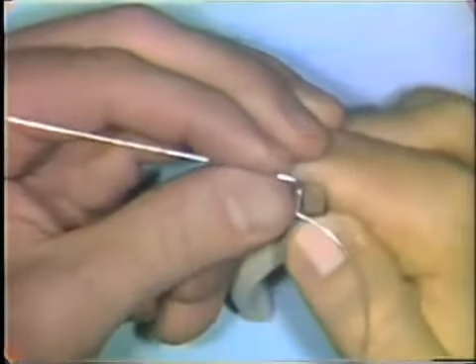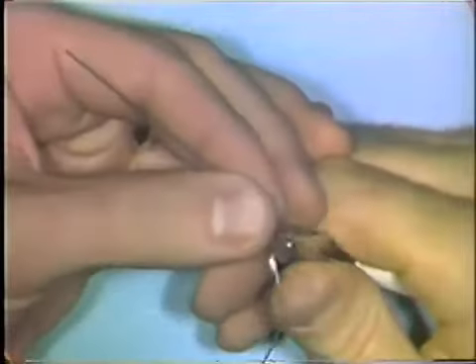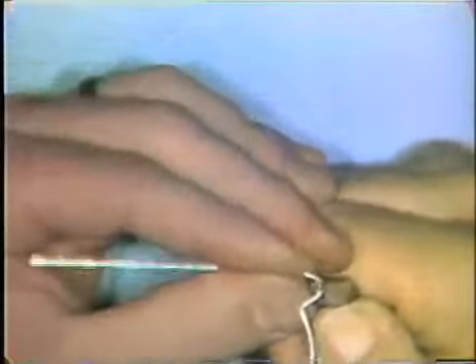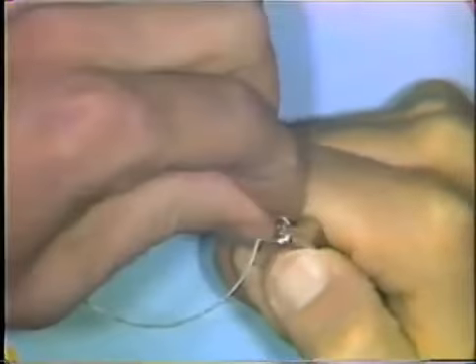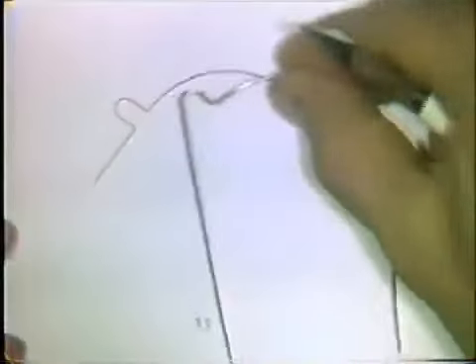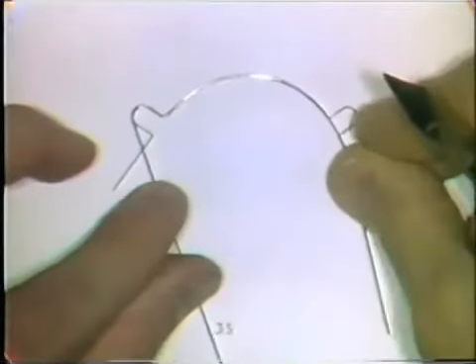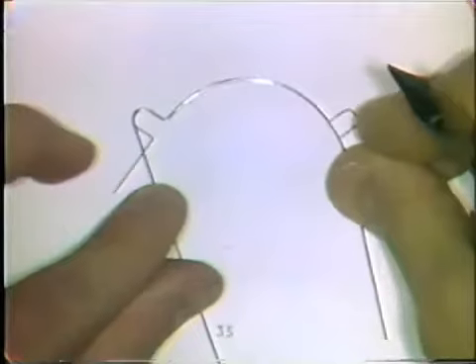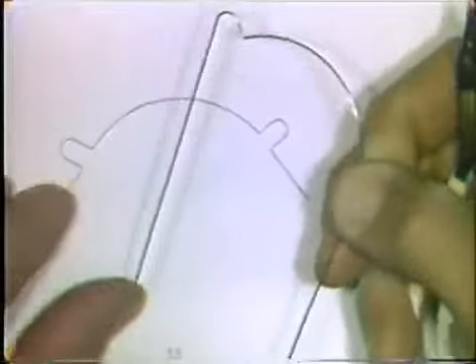By pushing that wire over that round beak, you can form that loop. Again, check the loop on the pattern to make sure you're moving along properly. And if you're satisfied with the curvature, continue and complete the formation of that loop.